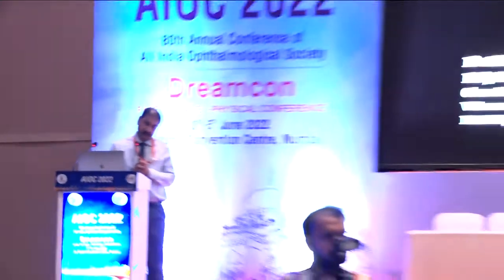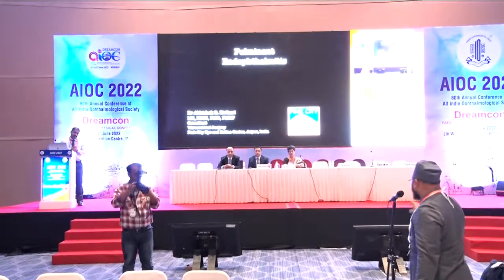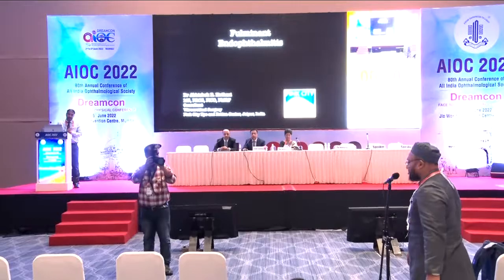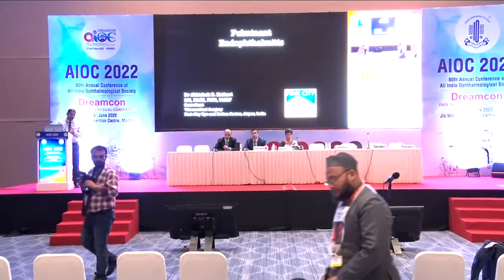Membrane peeling requires a very high degree of stereopsis and clarity. Having two or three media interfaces will actually hold the retina and pinch it at many times, and bleeding will start — and yes, bleeding is a big problem once it starts.